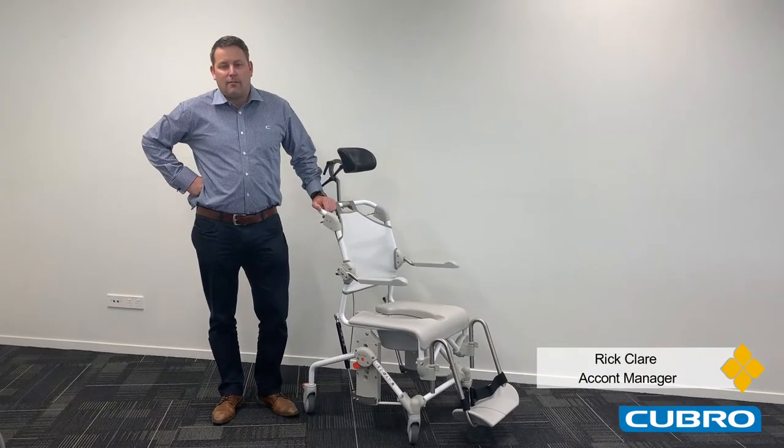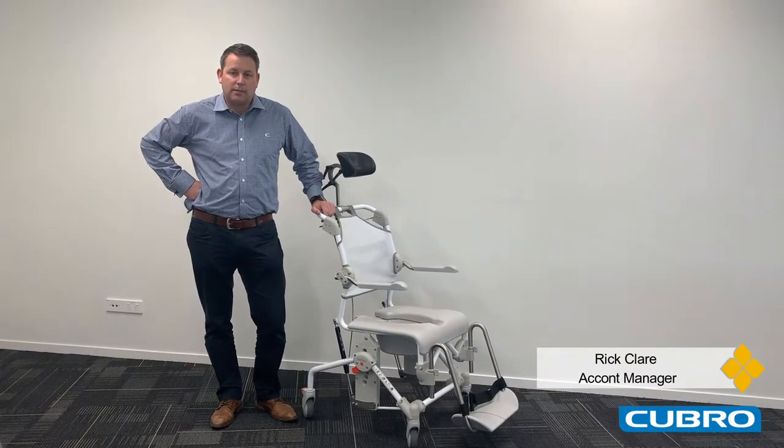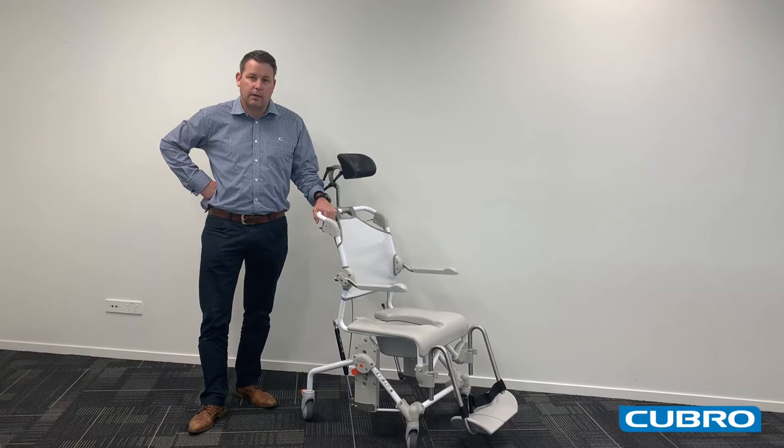Hello, my name is Rick Clear. I'm an Equipment Specialist and Account Manager at Cubro. I'm presenting today our ETAC Swift Mobile Showering Commode, which is also our tilt-in-space model.